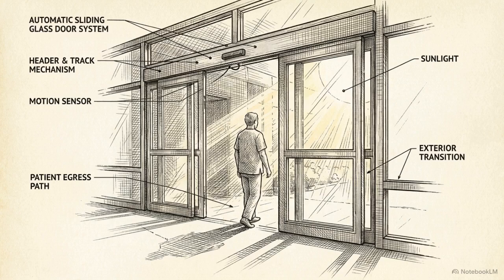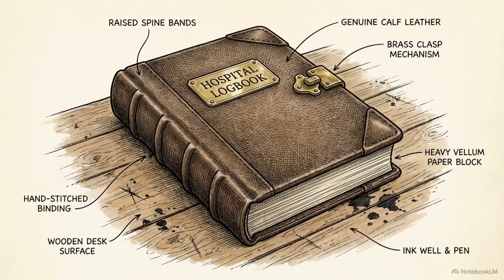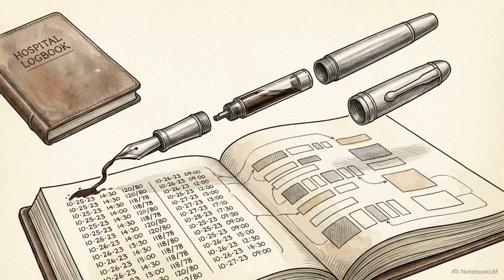A hospital's liability for a medical device does not end at the exit doors. Their responsibility for that technology extends indefinitely. Phase 4 governs the construction of the systemic ledger. Every step taken to mitigate a device risk must be meticulously recorded.